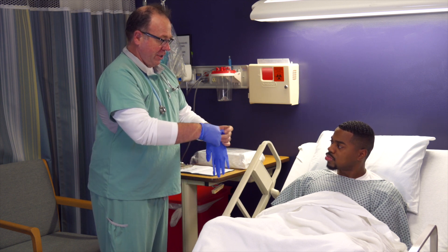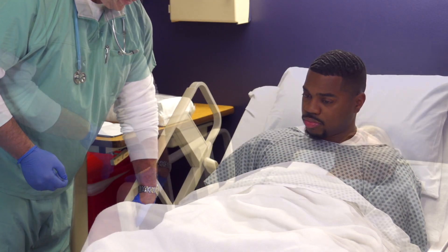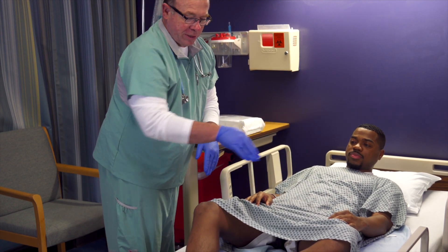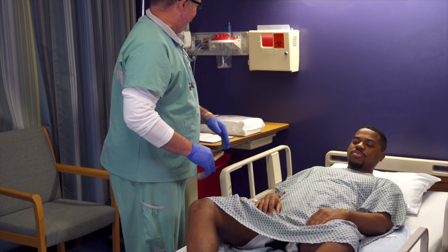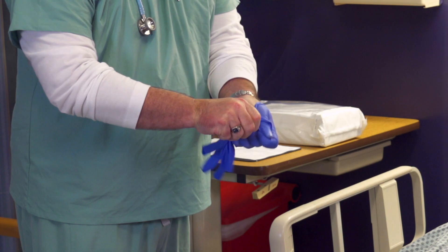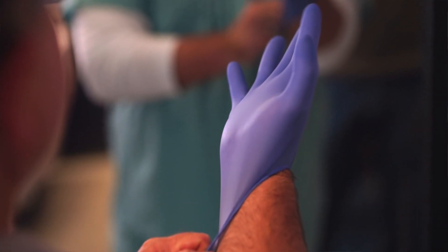Start by donning non-sterile gloves. Lower the head of the patient's bed to a flat position. Have the patient bend their knees with their legs spread and hips externally rotated. Stand at the side of the bed where your dominant hand is closest to the foot of the bed. Remove the patient's bed covers, pajama bottoms, or underwear. Remove non-sterile gloves and perform hand hygiene.